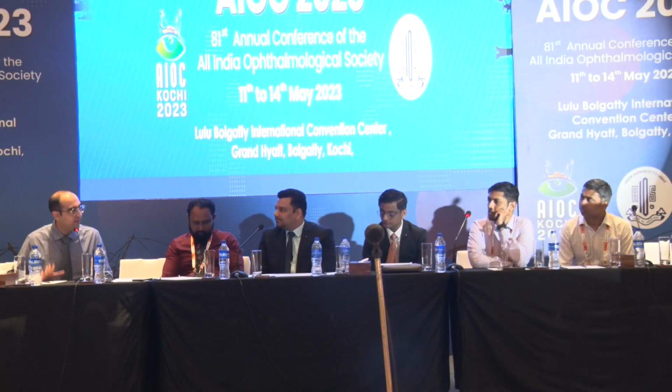Just one question to you. In which cases will you do iris claw, and in which will you use this Yamane technique? I think wherever I have the availability of a 3-piece lens, and there's not enough iris tissue, I would recommend doing the Yamane technique or any self-fixated lens. And again, the eyeball length also matters, the white to white. Other than that, if you're comfortable, the iris claw can also be a good option, definitely.